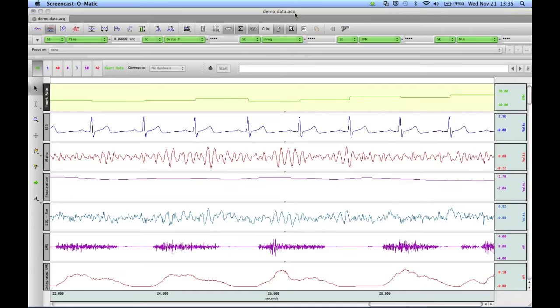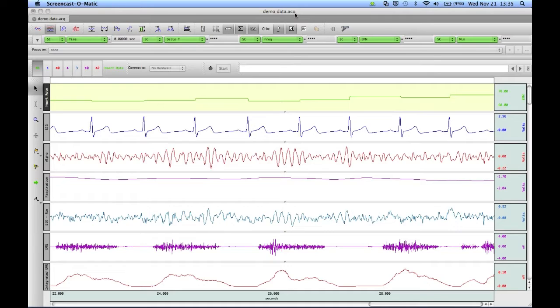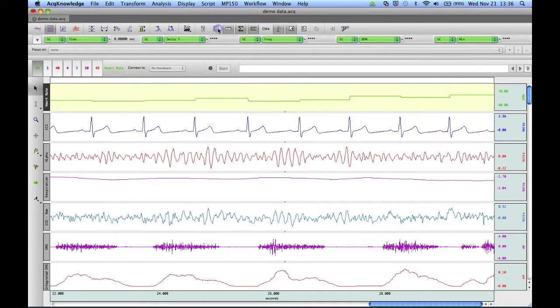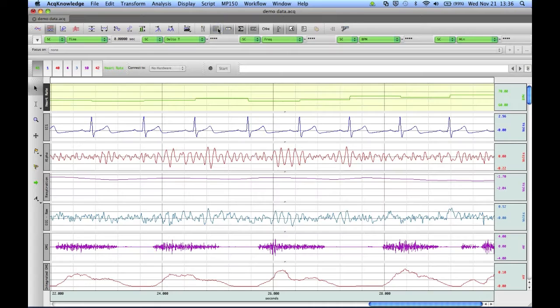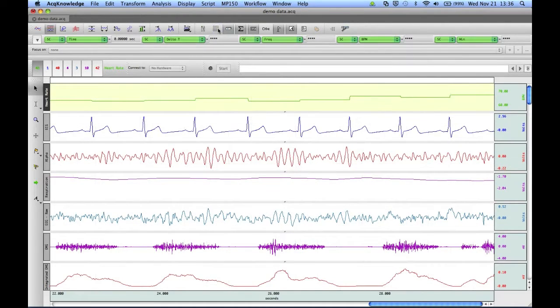There are a variety of useful ways that grids can be used when working with a data file. On a basic level, grids can be enabled or disabled for the entire graph by holding down the Alt or Option key and clicking on the grid button. Again, to remove, hold down and click again, and the grids will disappear from your graph.